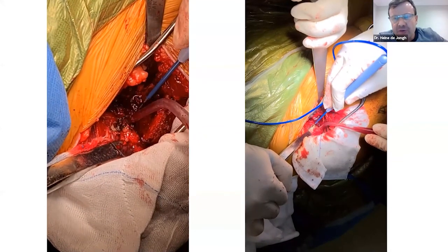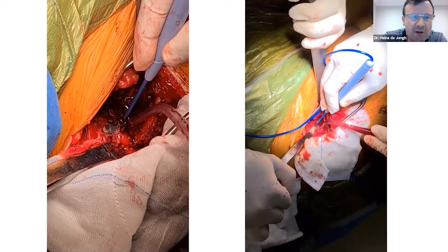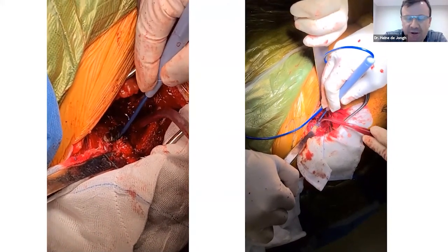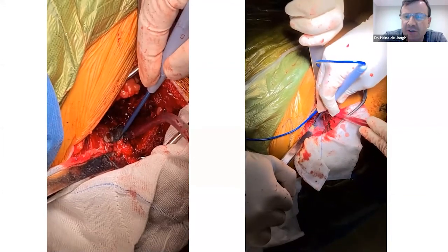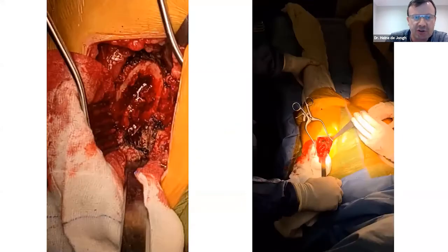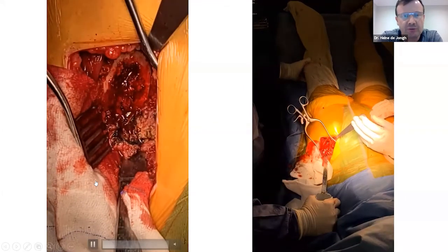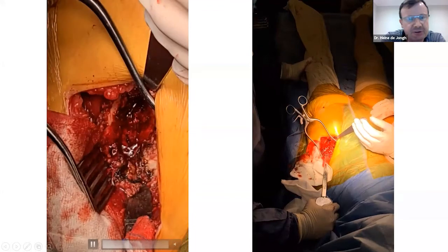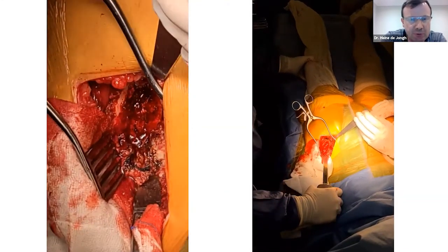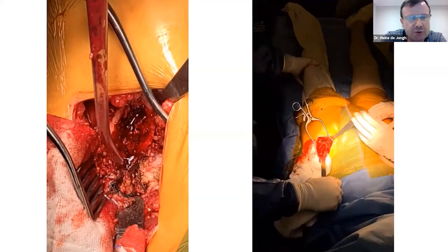And you just go through the capsule until you get that fat pad, and that's now a well-known or accepted anatomical landmark between the superior capsule and the gluteus medius. So that's, I suppose, all you need to do to achieve this. So this is what you are working towards: the elevation of the proximal femur. So you can see it comes up, and you should not use too much force. If you use too much force, then you're not ready to do the elevation.